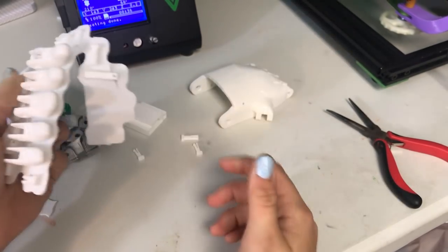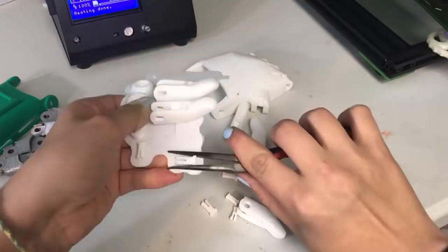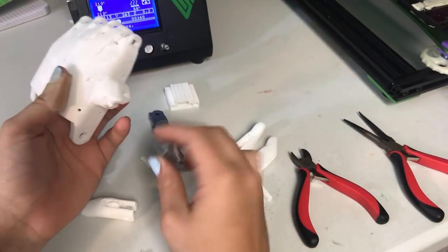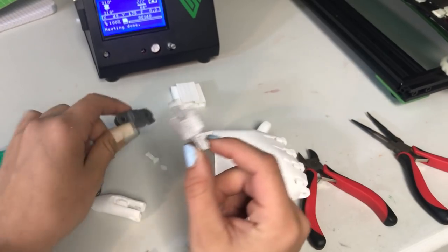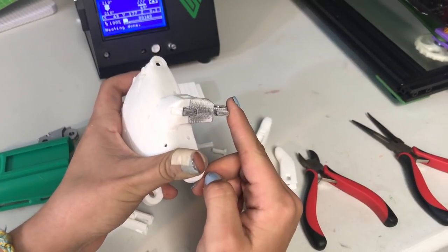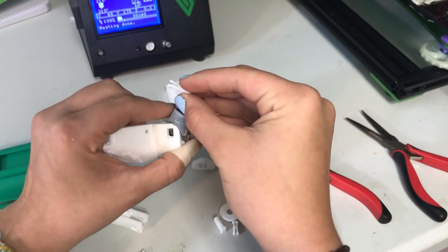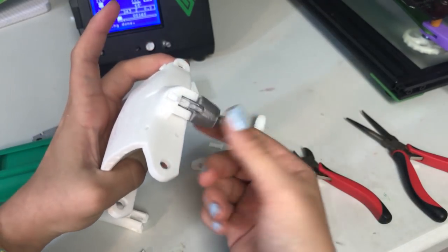I'm just going to take all these off the raft and then we can get to assembling the hand. The first thing I start off with is just adding the knuckle parts. As you can see, this one looks different compared to this one — we know this one is the thumb knuckle, so we just put it on this way. You guys can pause the screen if you want. Then you take the thumb knuckle pin and it just slides in. Make sure you put it in the right side and it pops in just like that, so now this is connected.